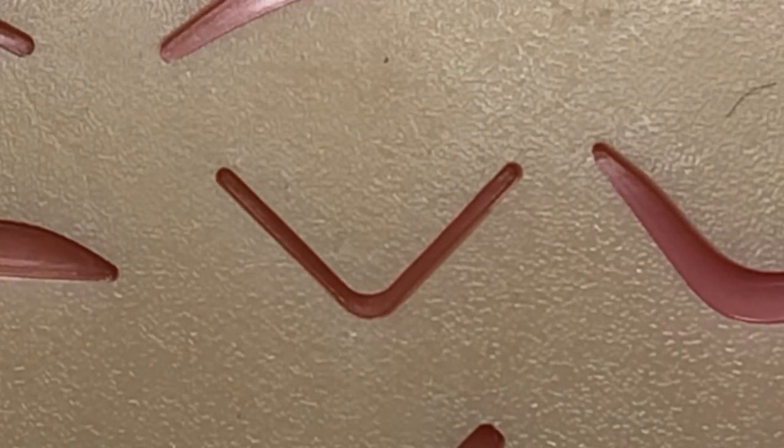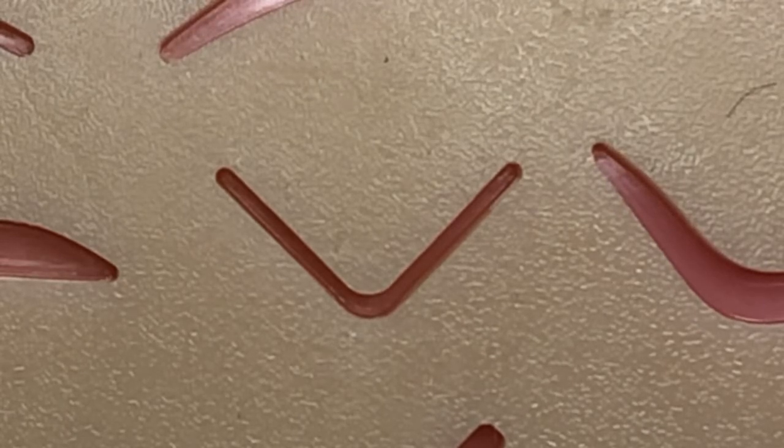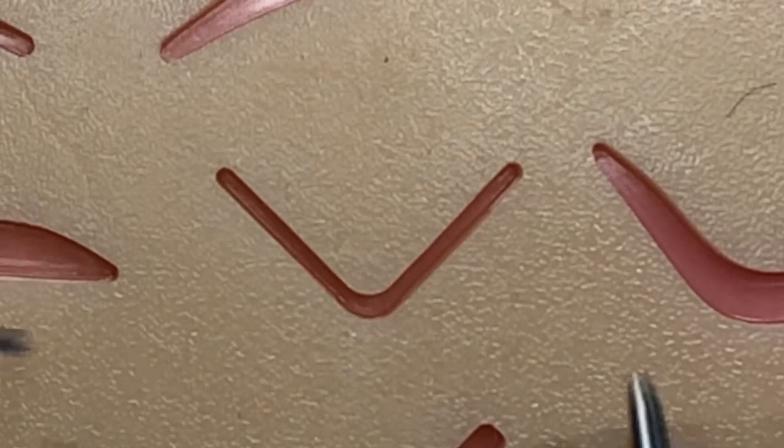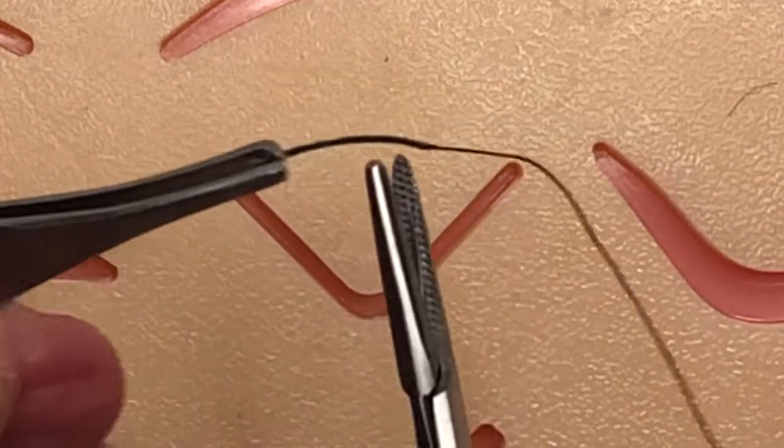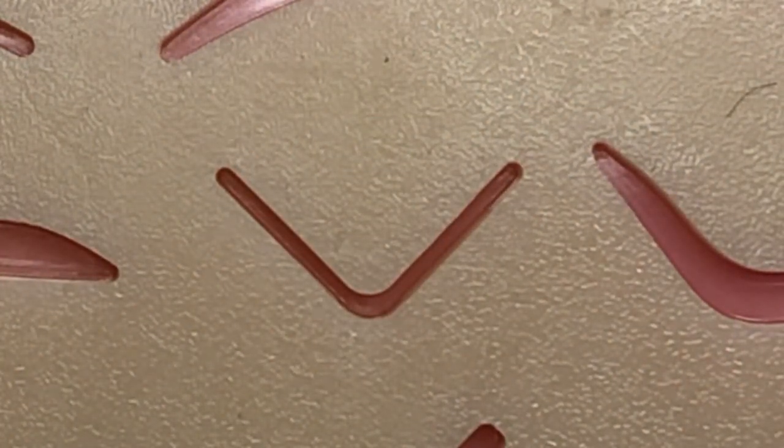All right, so next what we're going to do is we're going to try to do this with the horizontal mattress, just to demonstrate what that looks like.